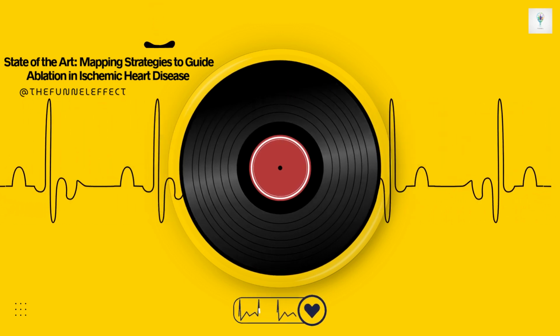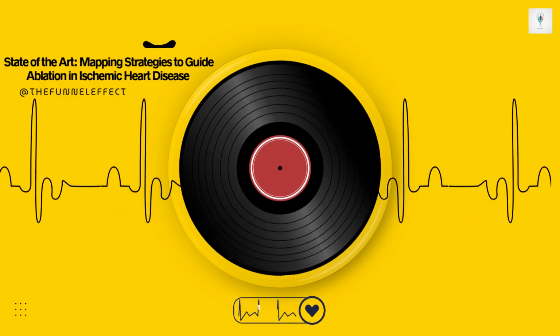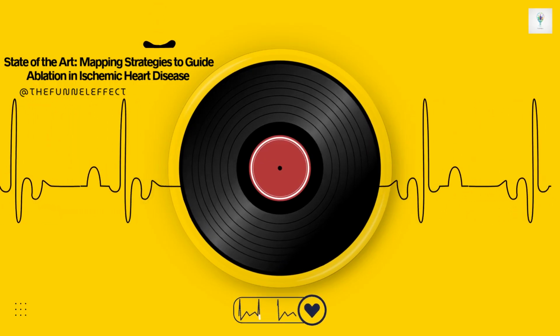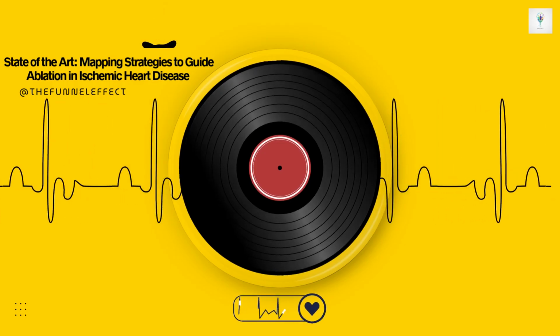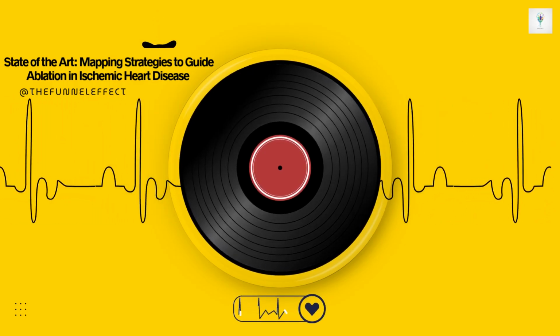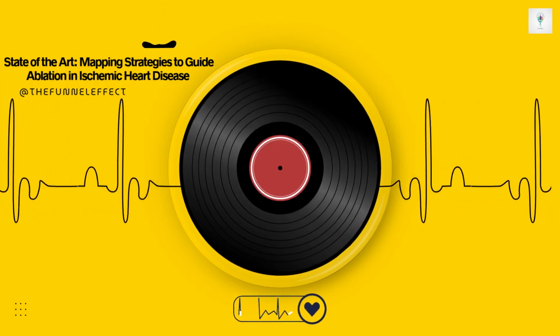But how do you know you're pacing from within the slow isthmus itself, and not just from nearby healthy tissue that happens to activate at the right time? That's where the stimulus to QRS delay, SQRS delay, comes in. This is crucial. When you pace directly from the isthmus, the electrical impulse you deliver first has to travel through that slow, winding pathway within the scar before it can emerge and activate the rest of the ventricle to generate the QRS.